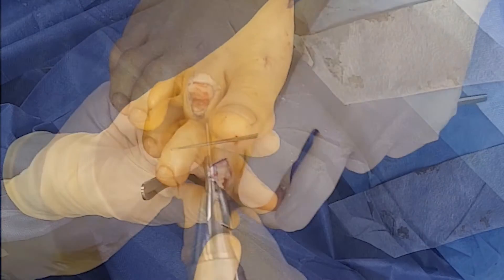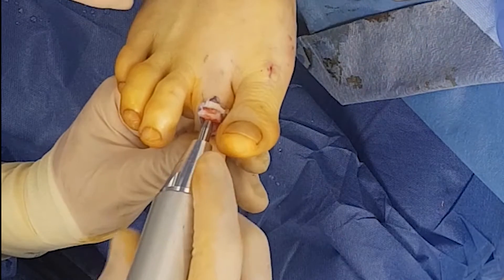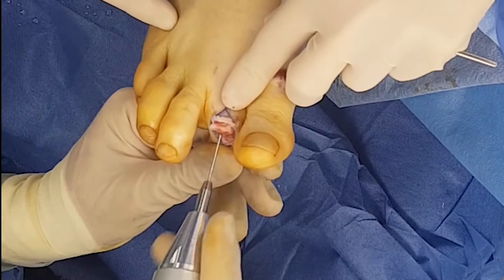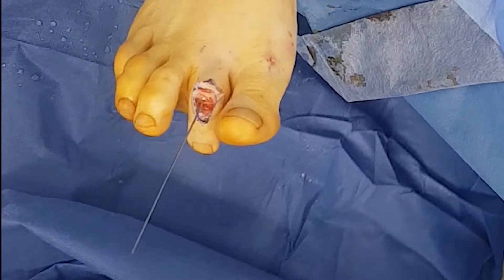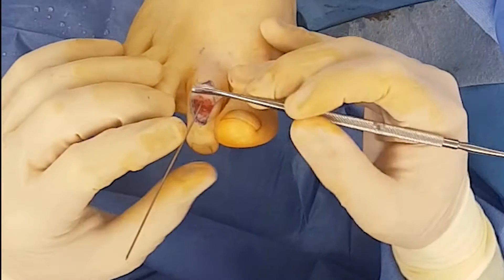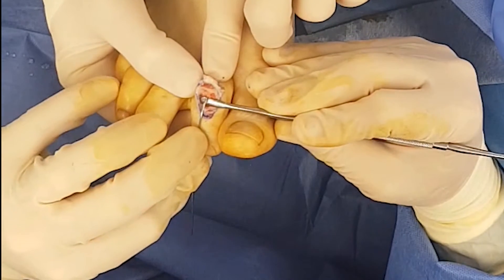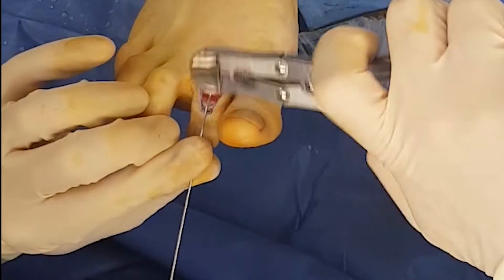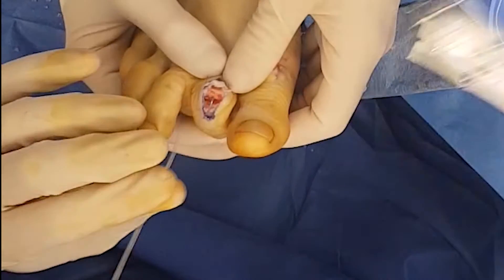There are a number of ways to fixate a fusion site. What we're going to use is a 1.4mm smooth K-wire, and that's going to be placed in situ, which means it won't be exposed. A lot of surgeons will use the K-wire percutaneously and pull that out after six weeks. In this case, we're going to keep it internal so we don't have to pull the wire out, meaning the patient will be able to ambulate in a normal shoe a lot sooner, as the wire doesn't need to be poking out the end of the toe.